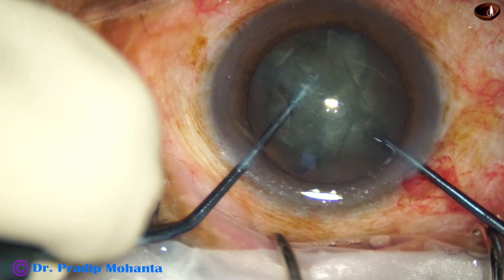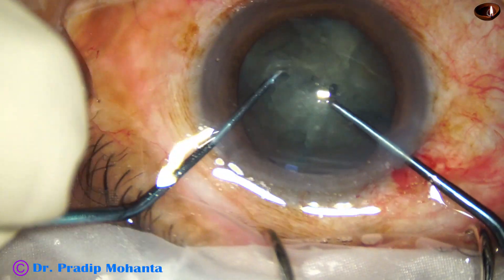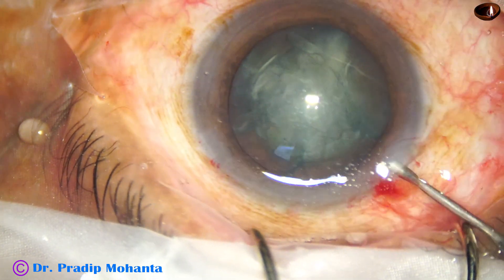One hemi-nucleus is divided into two pieces, then the other hemi-nucleus is also divided into two pieces. Now the phaco needle goes in.